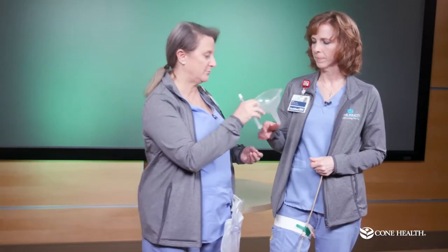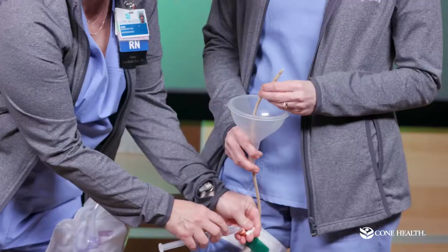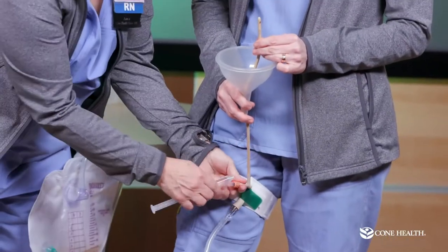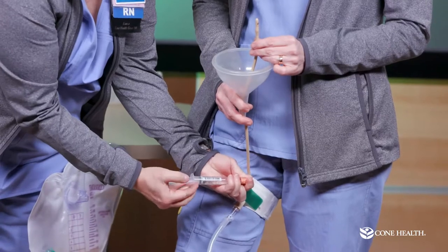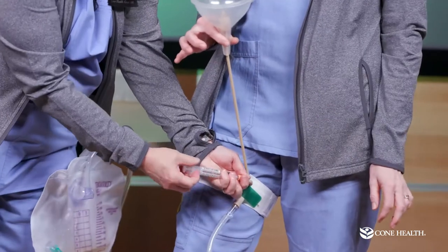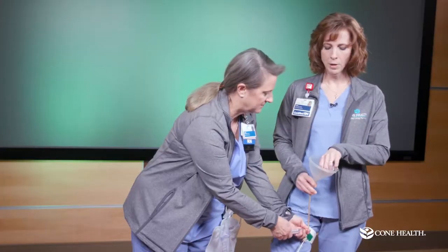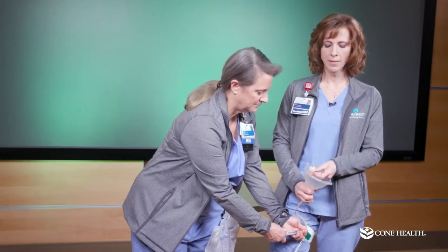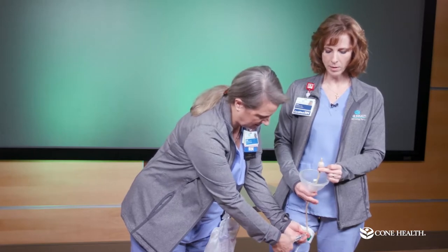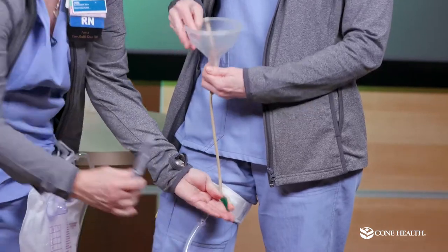We're going to show you how the catheter stays inside you. We feed the catheter up into the bladder, and through the Y port we inflate a balloon with saline. That balloon wedges down into the neck of the bladder, which is what holds the catheter in place so it won't fall out when you stand up. When you go back to the urology office, they will deflate the balloon by drawing the saline out through that port, and the catheter slides right back out.